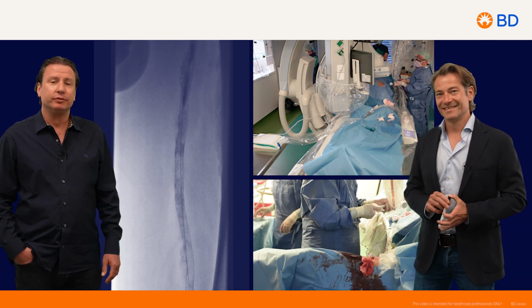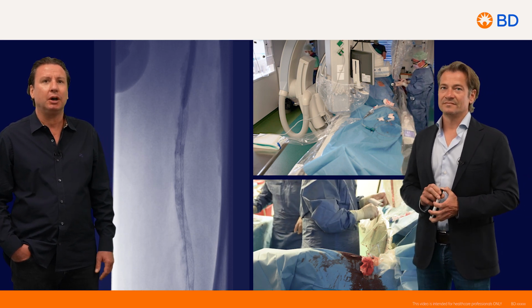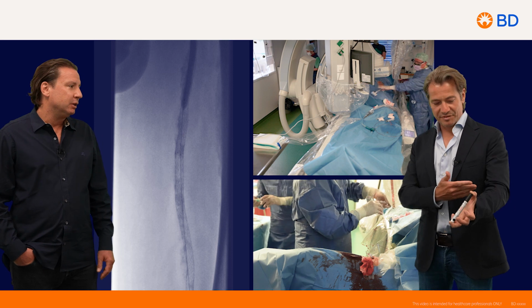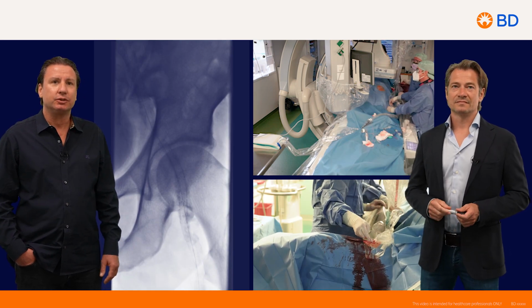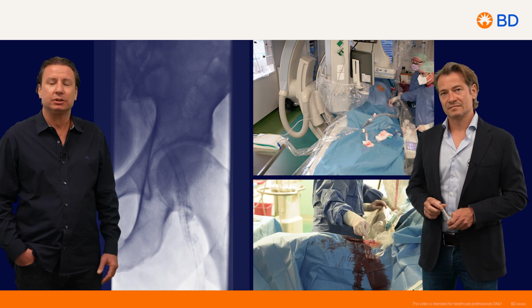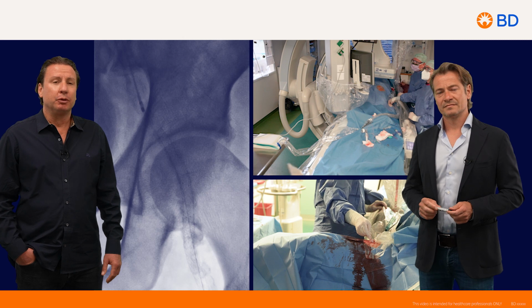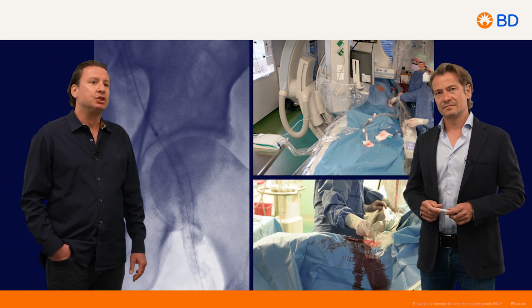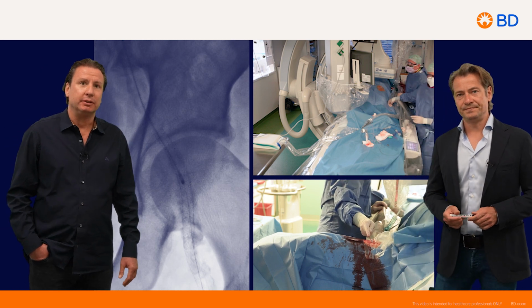However, if you come from the arm, I need 8 French long sheaths from the arm, which maybe can be too big for the brachial artery. So of course we want to avoid any puncture site complications. And furthermore, the 8 French device does not have the shaft length of 135 centimeter as the 6 French device.